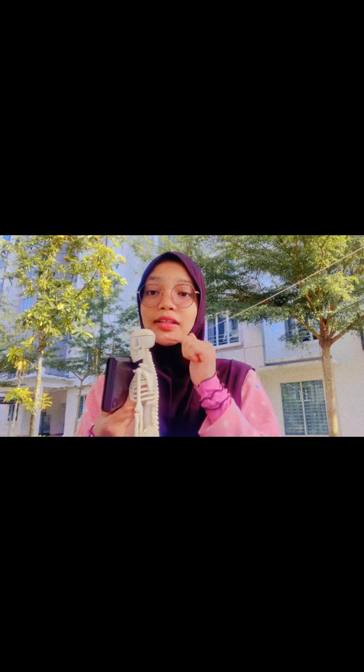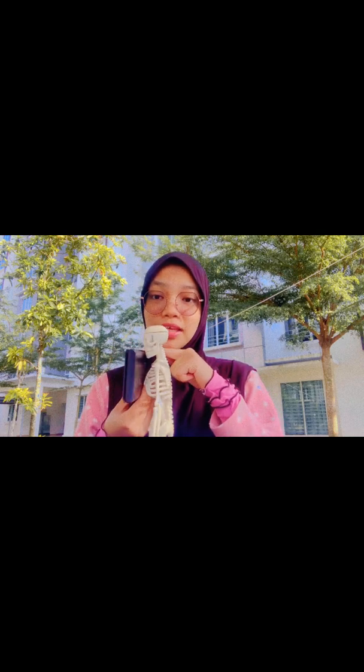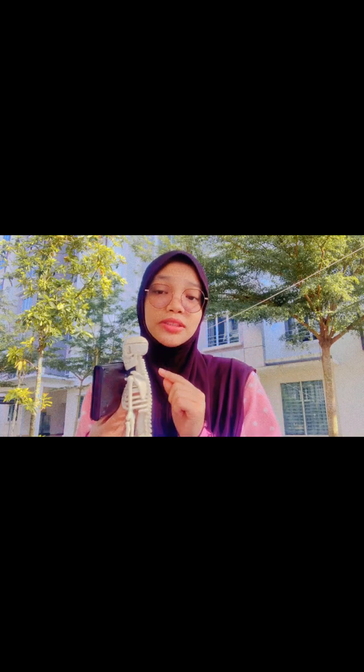Rotate the shoulders anteriorly and depress downward in order to move the clavicles below the apices. Make sure the top of the image receptor is 4 to 5 cm above the shoulder, and the CR is directed towards T7, which is 3 to 4 inches below the jugular notch, which is at level T2 to T3. For the respiration, we're going to ask the patient to suspend at full inspiration in order to allow the diaphragm to move downward. To collimate, make sure we include all 4 sides of the lung fields.